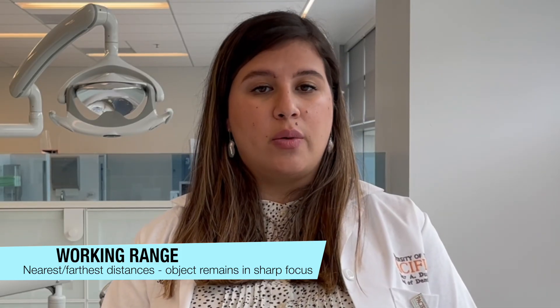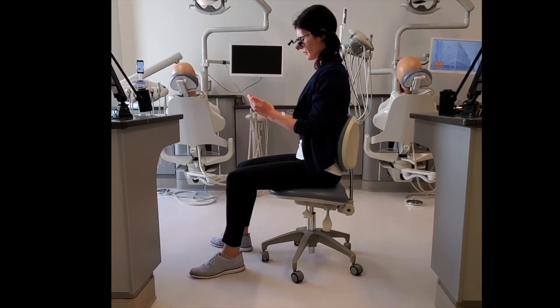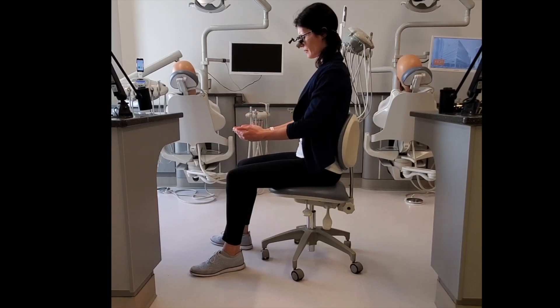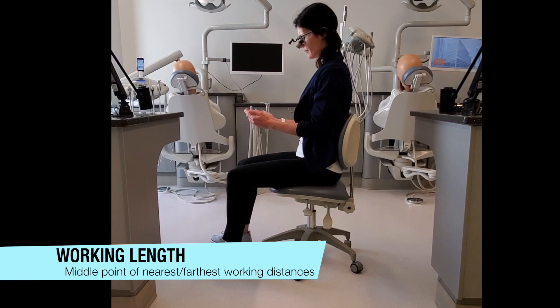In our case, the object is a tooth. The midpoint of these two measurements is our working length. Here you can see the dentist's nearest working range distance is 16 inches and her farthest is 24 inches. Since the midpoint is 20 inches, this would be her working length.